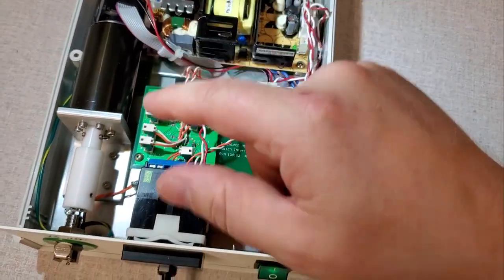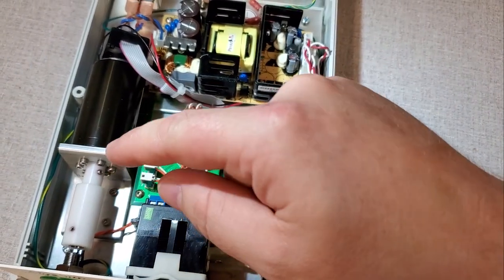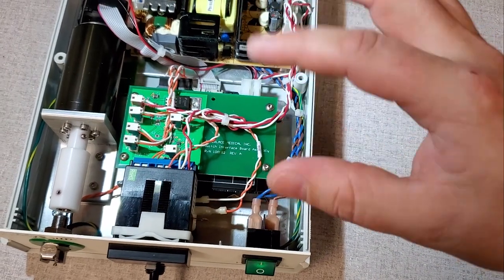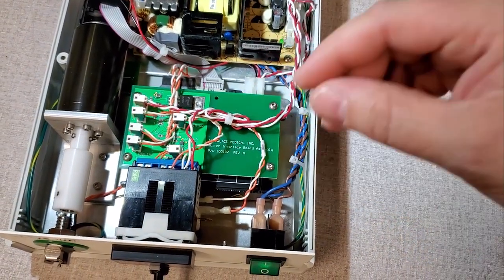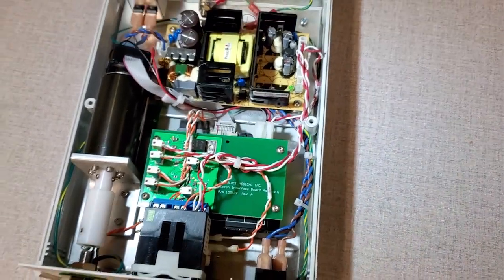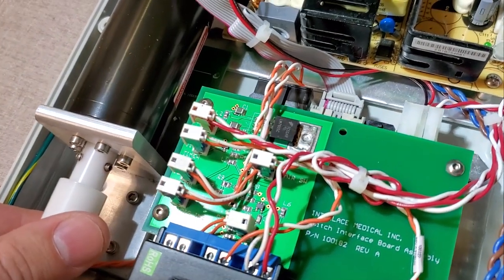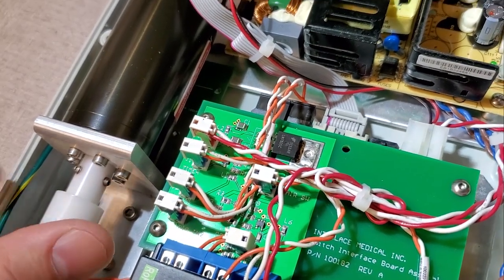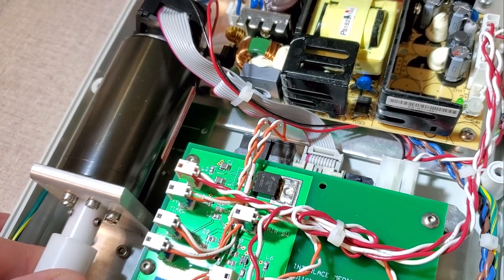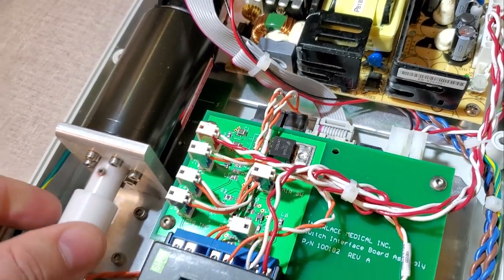Now the reason they do this is not only so that you can adjust the period of time that it's spinning. You can tell I press the foot control and I release it, and it continues spinning for a very designated period of time. But what it also does is it gives you the ability to detect errors. Now you can see down there, see the green flashing light on the motor? You can see it right here. Now watch as I stop the motor. See how it flashes red?